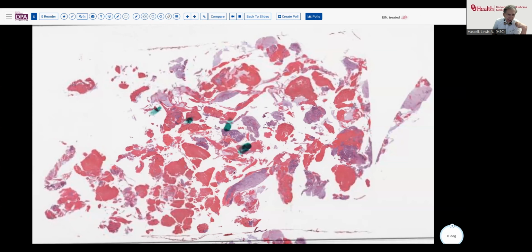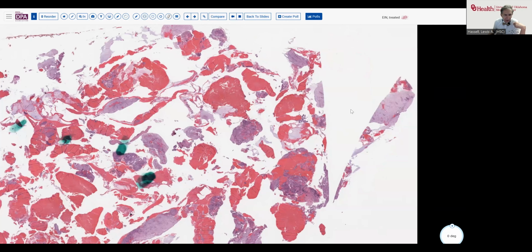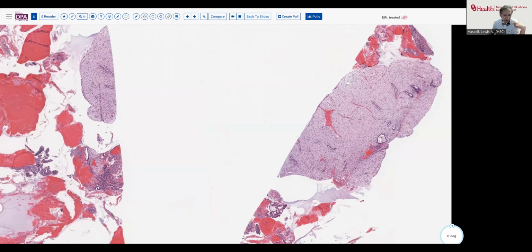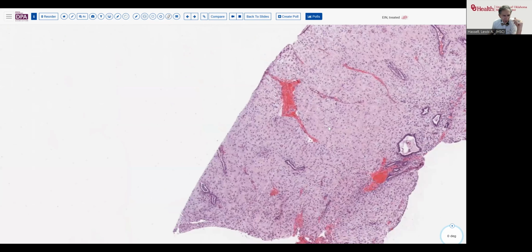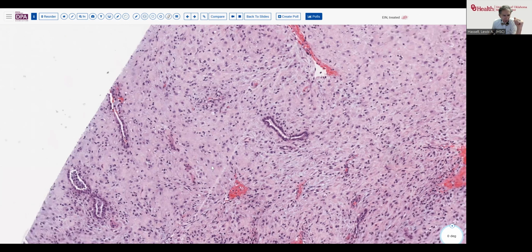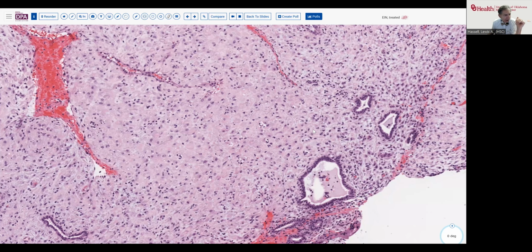And this is a case where I think we see very nicely developed over here the decidual change. And this is kind of the more classical type of decidualization where the stroma is very pale, kind of pale pink with these small nuclei. And here you see these very, very atrophic glands that are characteristic of the exogenous hormone effect. So clearly this patient is getting a therapeutic dose.